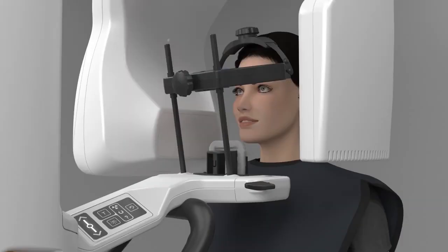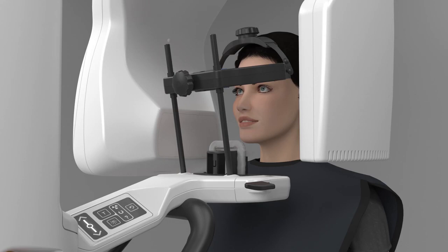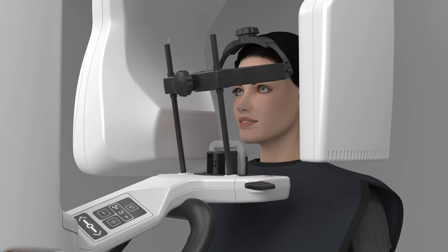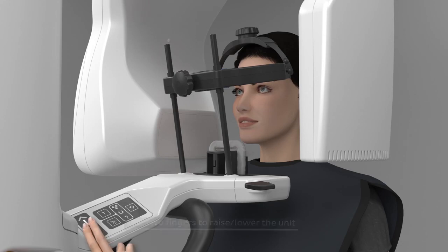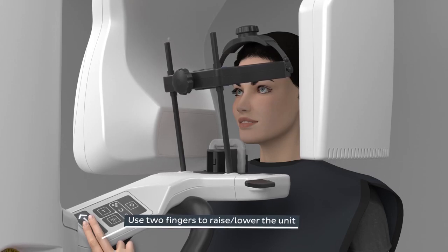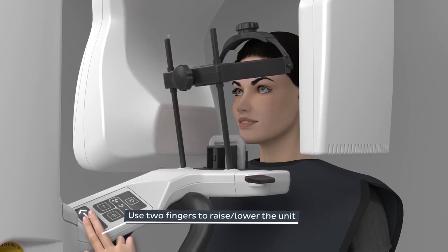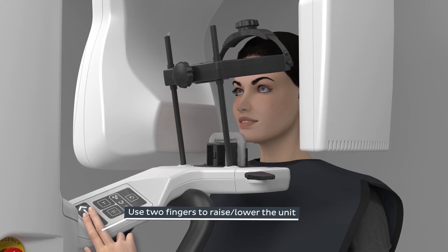Have the patient stand in front of the unit. Instruct the patient to stand as straight and tall as possible. With the patient standing outside of the unit, raise or lower as needed so the patient's chin is level with the chin rest.